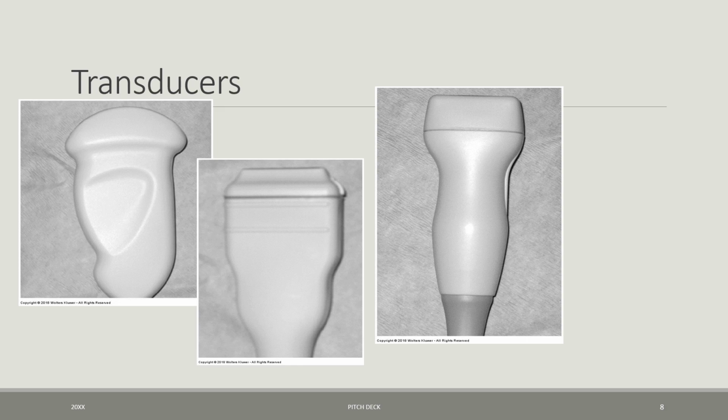Okay, now as sonographers, you are all very familiar with your transducers. So here you see the curvilinear transducer. Here we have a linear, and here we have another linear. We are going to be able to use all of these in our vascular scanning.